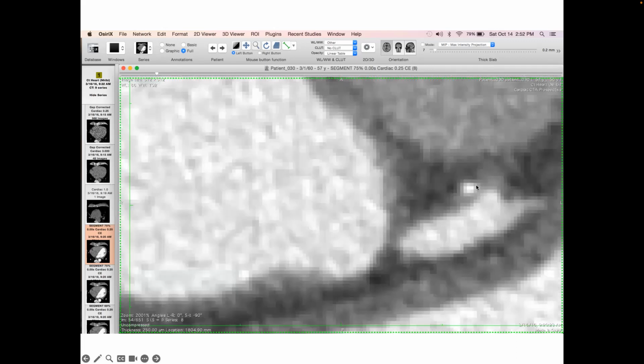So if we go right in, you can see these boxes, and even on the edges here, you can see these boxes. So to display the image, we should really take these values and interpolate them. If these are truly the highest frequency we can measure, we should take those values, interpolate them, and display them so it looks like that, right? So this just uses more pixels. And so now I get rid of that artifact, which are these boxes, okay?